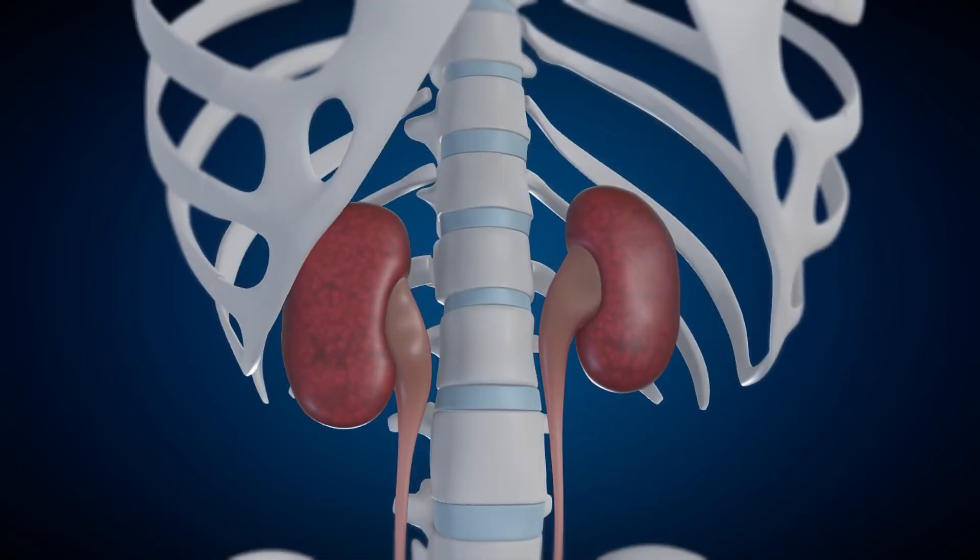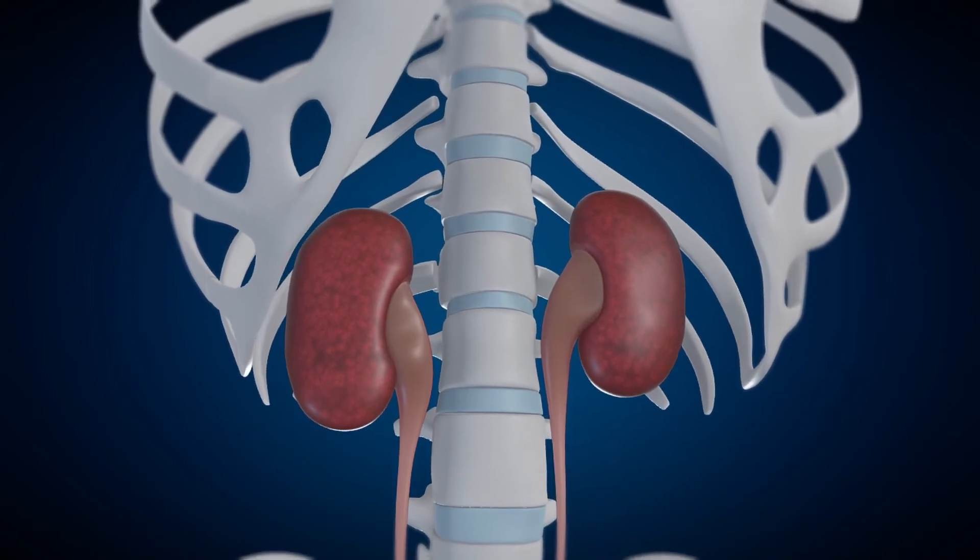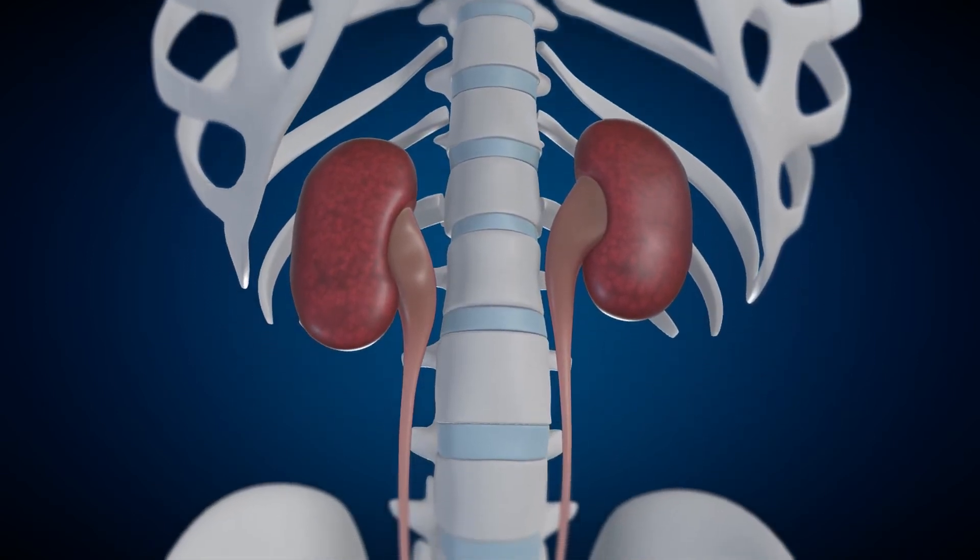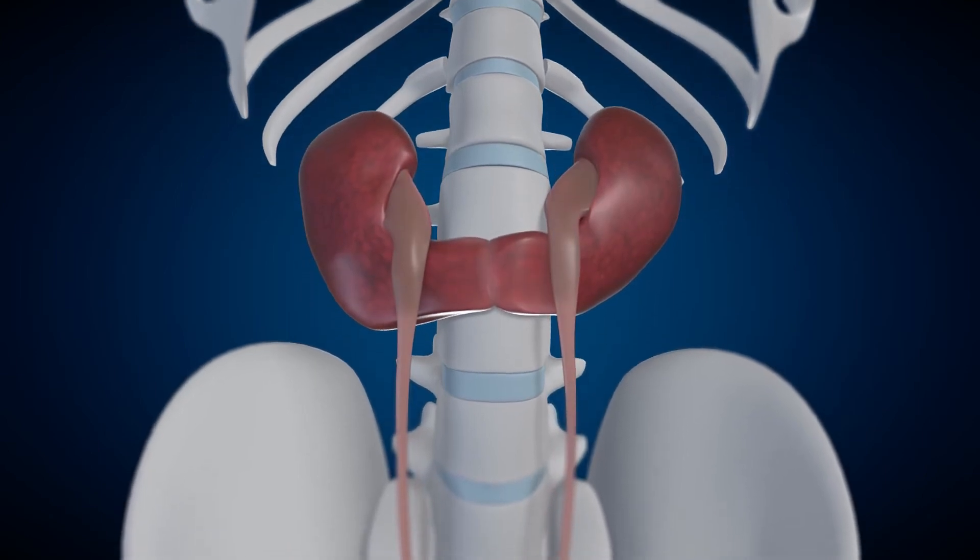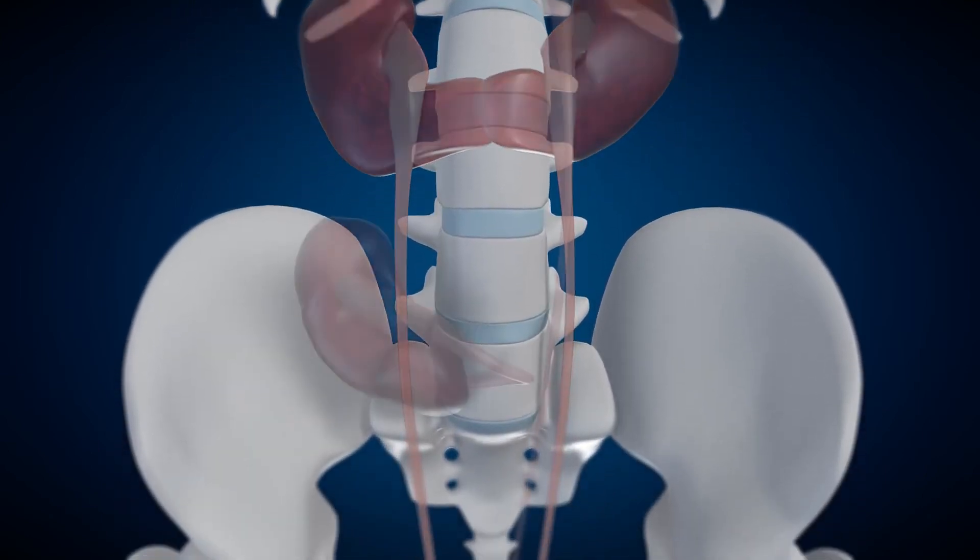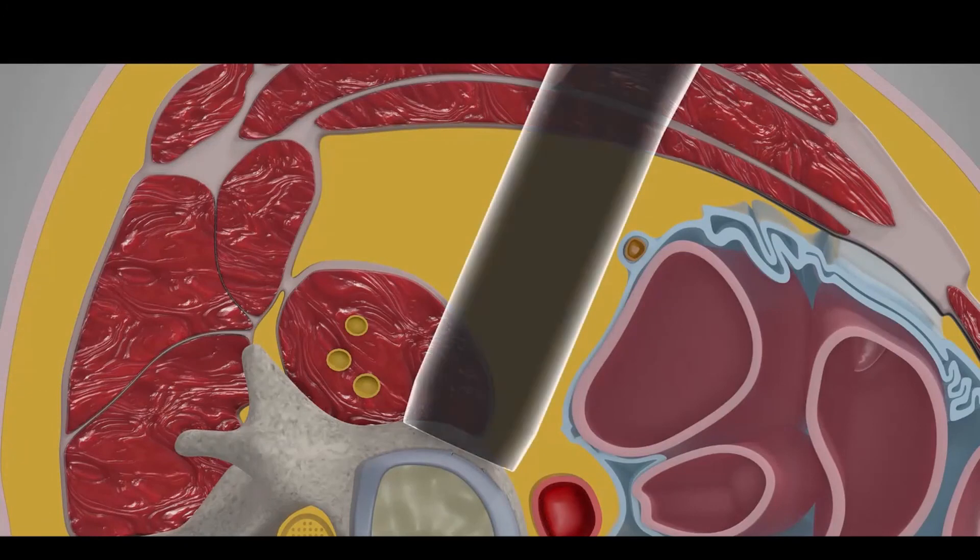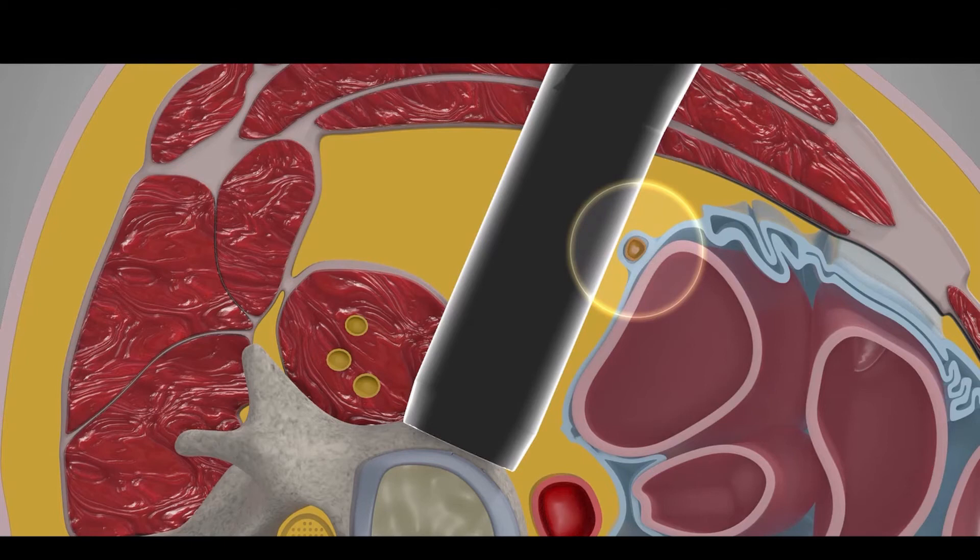As part of preoperative planning, surgeons should evaluate for abnormalities of the kidneys, including a history of a kidney transplant, a horseshoe kidney, or a pelvic kidney. The ureter is usually attached to the peritoneum and will move anteriorly with the peritoneal contents as they are swept forward. Retractors may be used to directly visualize and protect the ureter.